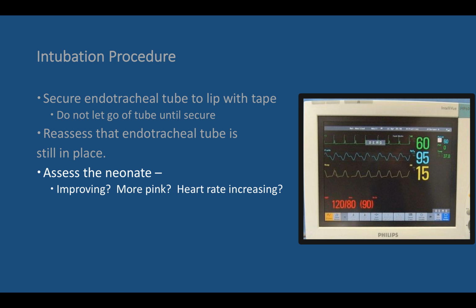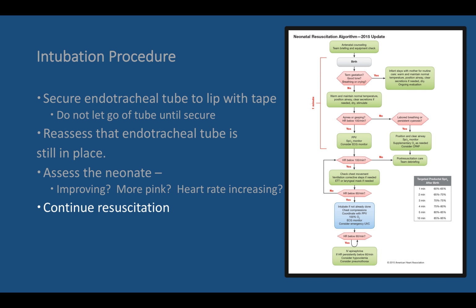You're going to continue to assess the neonate. Are they improving? Are they pink? Is their heart rate increasing? Which is the best indicator of correct placement and improving oxygenation status. Please note, the vital signs on that monitor definitely don't correspond to a good neonate. And you're going to continue resuscitation as needed following your NRP guidelines. There are a few common problems we're going to cover quickly.